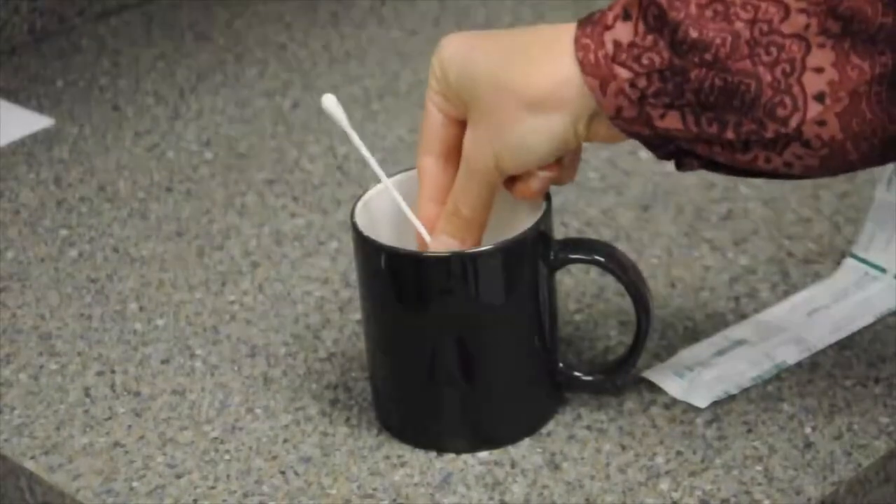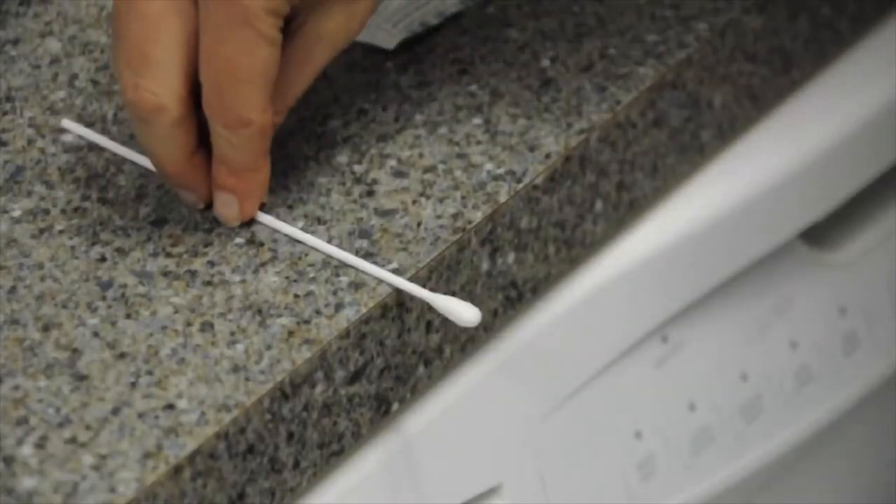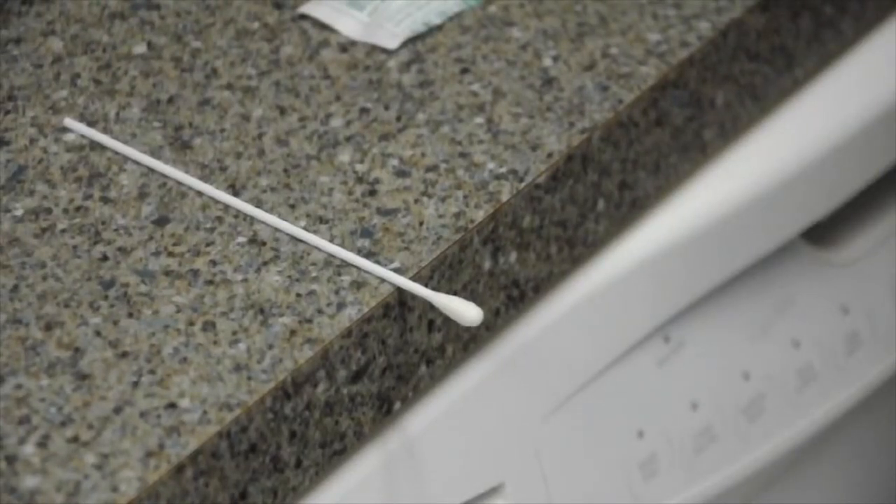Place the swab into a cup with the cotton end sticking up, or lay the swab on the edge of a countertop, making sure the swab tip is hanging over the edge and not touching the counter.